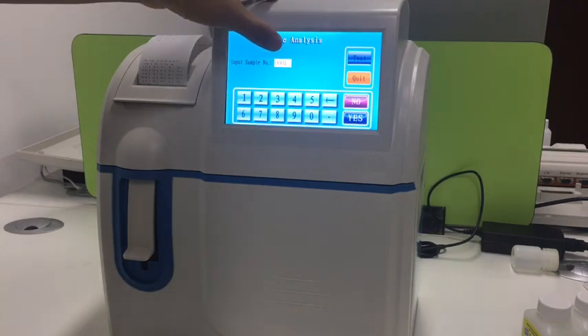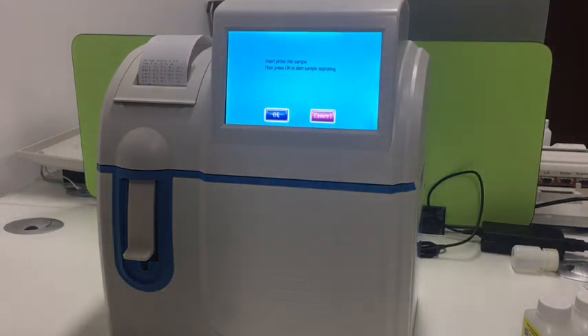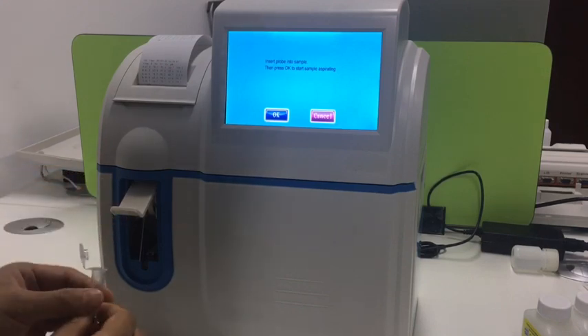This is the start ID. Press test and just wait for the result.